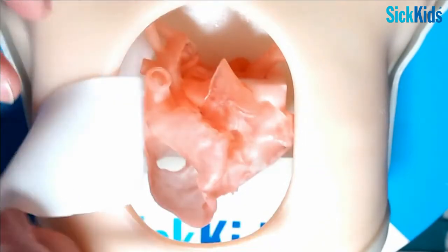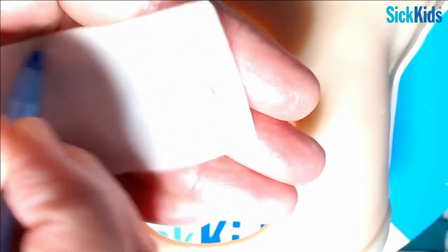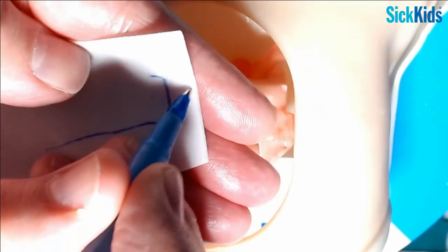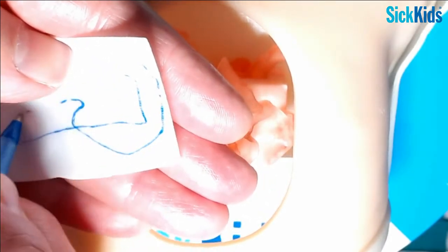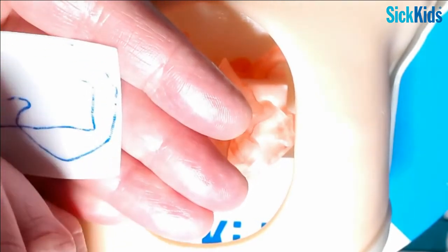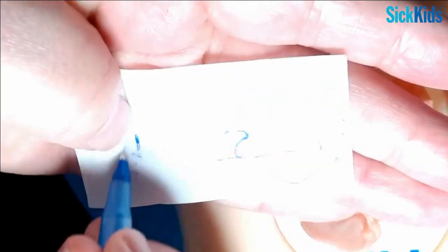There's all kinds of ways of doing patches. You can do a simple triangle that's kind of shaped like this and comes up like this. Most of the time the patch I do looks something like this. We take this edge off here. You get a bit of a shape something like this. So it looks almost like a shark's fin, a big comma. That's not drawing on there, but it's a big long tail.